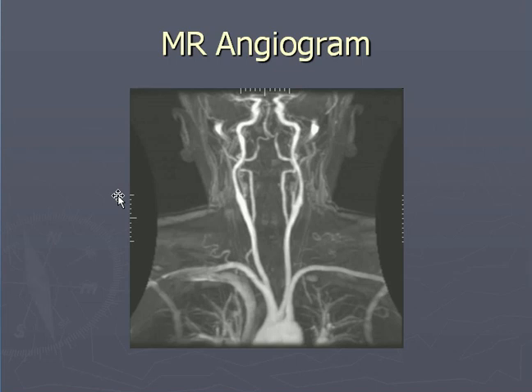The important thing to note here is that in MR angiography, we need not give any contrast, but the presence of the blood in the vessels is exploited and the angiographic images are acquired.